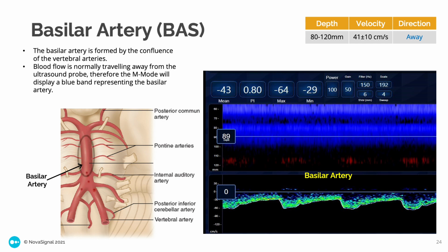I've mentioned several times already about listening and eyes. It's not that one is more important than the other. Sound is very important. Eyes are very important. You need to use both to improve your accuracy and efficiency.